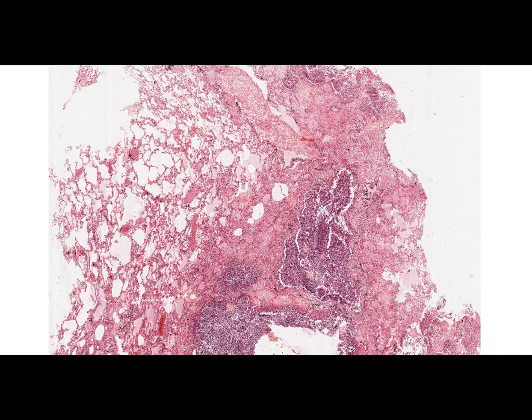Firstly, it is a Croupous inflammation, which is a kind of fibrinous inflammation and which is characterized by the predominance of fibrin strands in exudate that are loosely associated with underlying tissues. Secondly, it is a purulent inflammation, in particular limited purulent inflammation known as abscess. Purulent inflammation is characterized mainly by the predominance of neutrophils in the exudate.